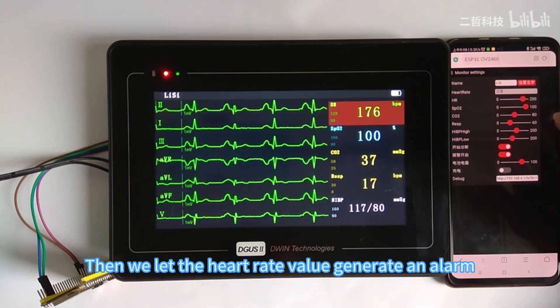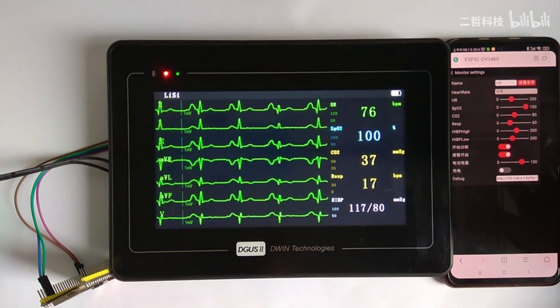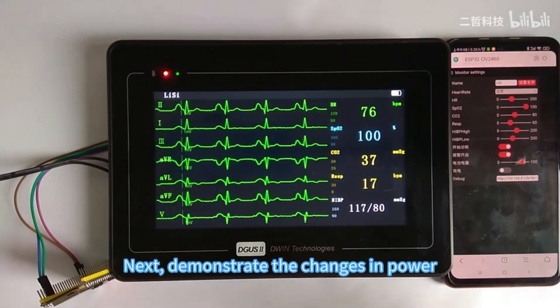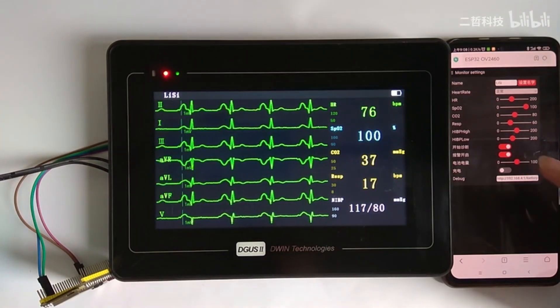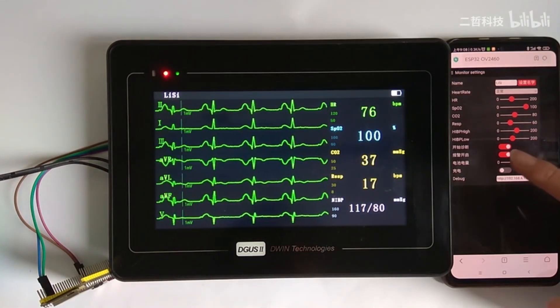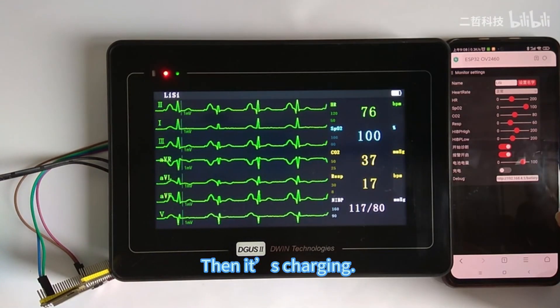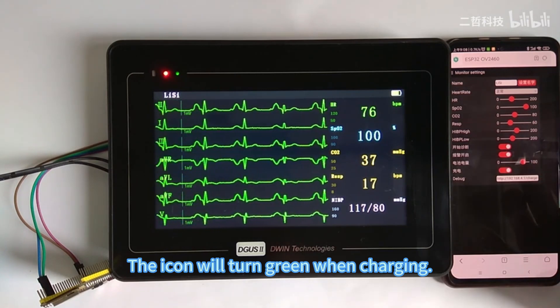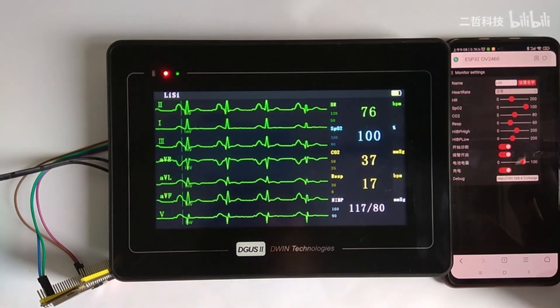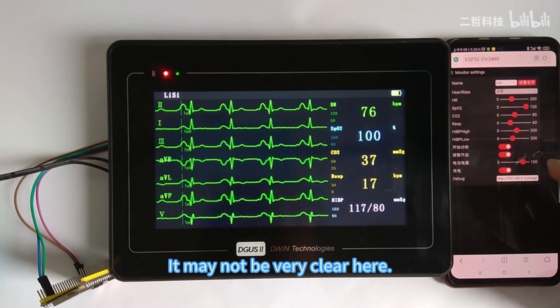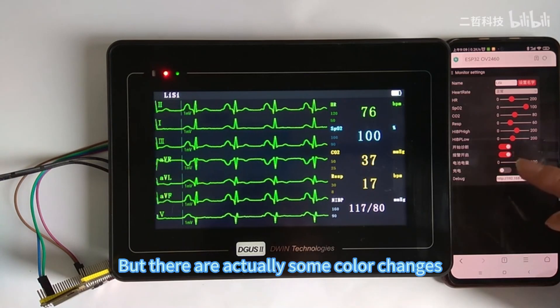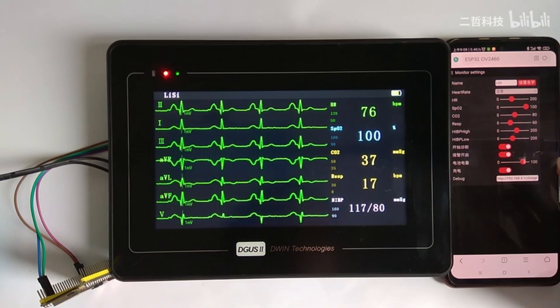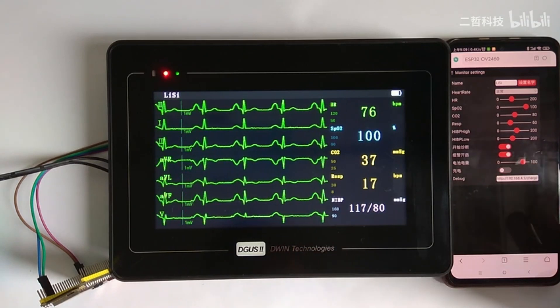Then we let the heart rate value generate an alarm. Next, we demonstrate the changes in power. When charging, the icon will turn green. It may not be very clear here, but there are actually some color changes.